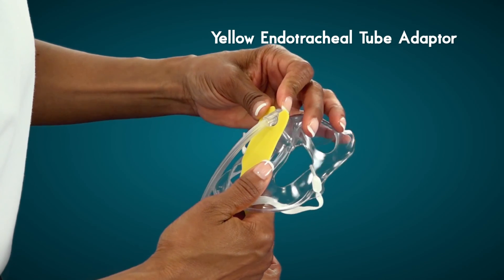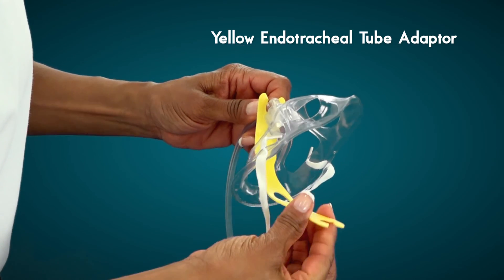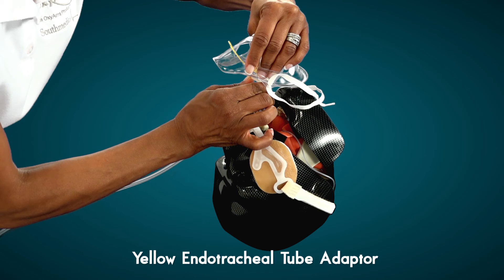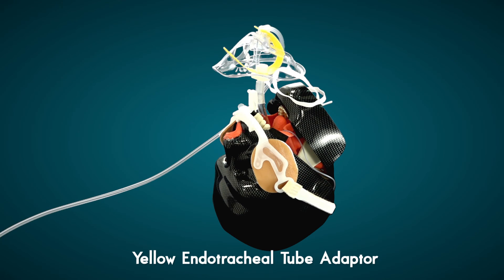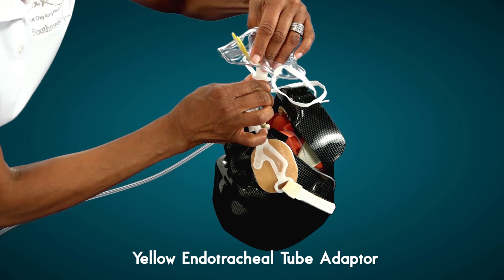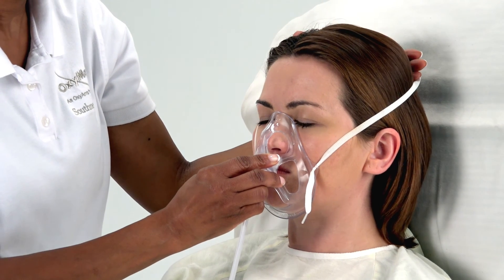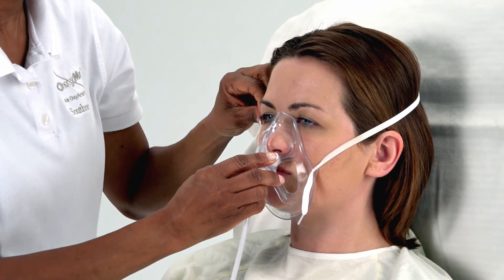A yellow endotracheal tube adapter is available upon request and can be easily attached to the OxyMask. This adapter attaches directly to the connector of the endotracheal tube or laryngeal mask, providing oxygen to the spontaneously breathing intubated patient. Once the patient is extubated, remove the yellow adapter and place the OxyMask directly on the patient's face to deliver oxygen therapy in the usual manner.